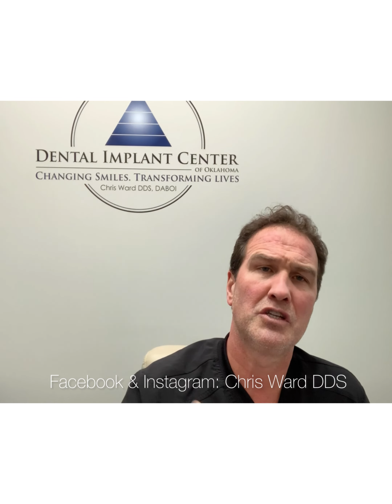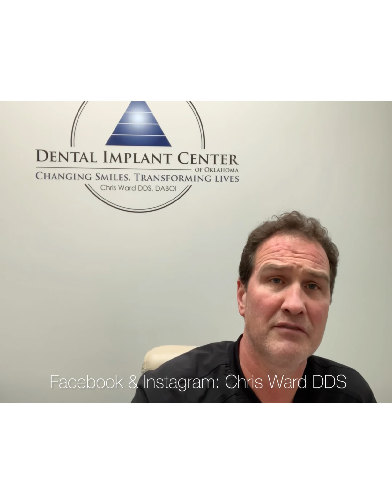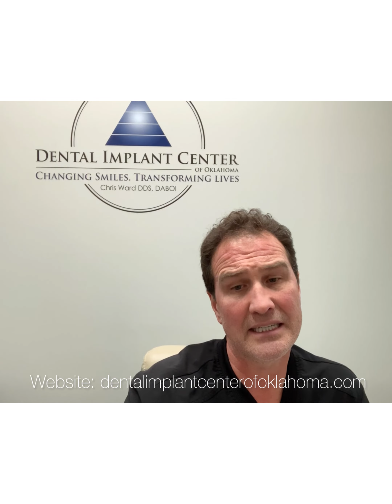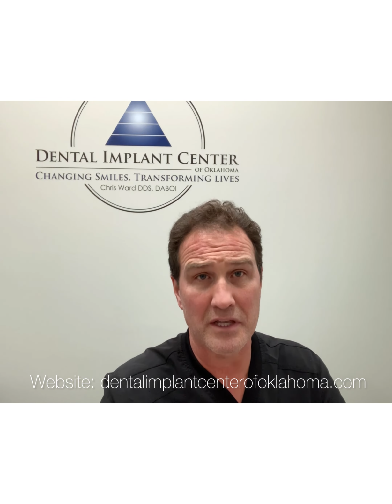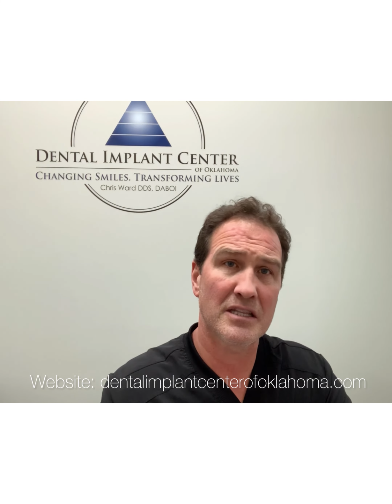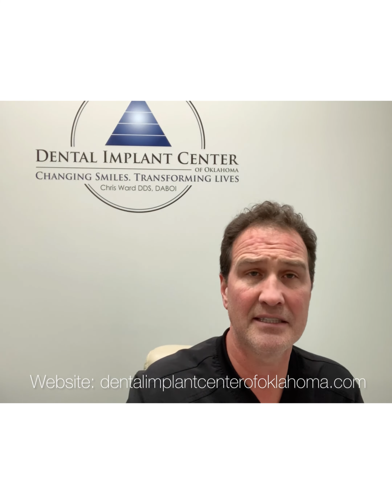When you deal with the lower jaw, once you've really lost the majority of the bone, it gets a lot more complex. There's subperiosteal implants, where those games have changed. We used to have to try and take impressions, literally with impression material, of the bone itself, and then try and manufacture something that fit to the bone as precisely as possible. And then it's screwed into the bone in different areas, and it has little pillars that come up that then we can attach the teeth to.